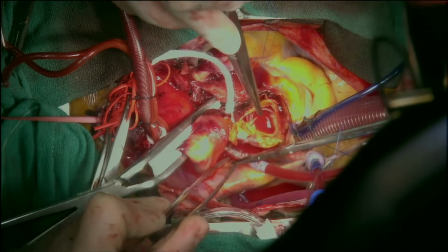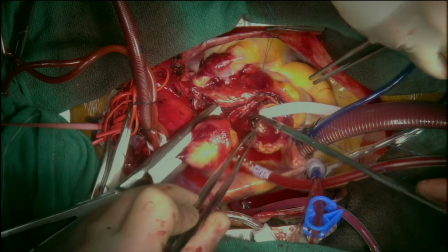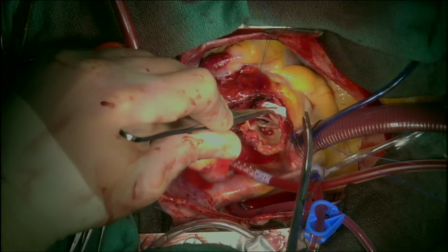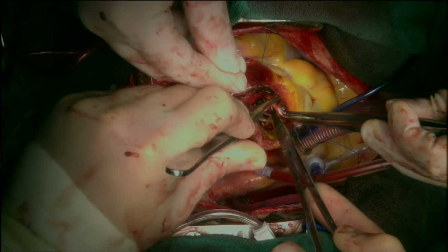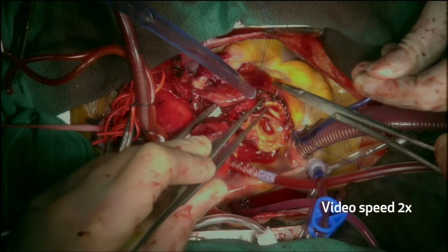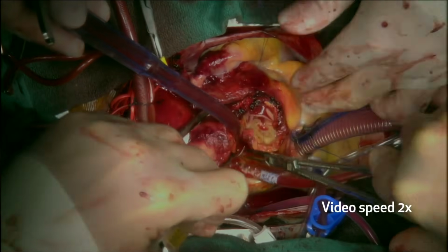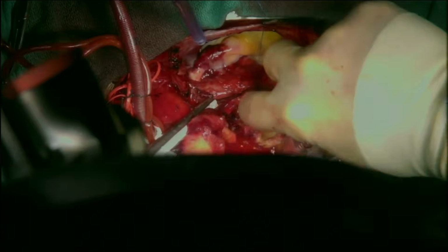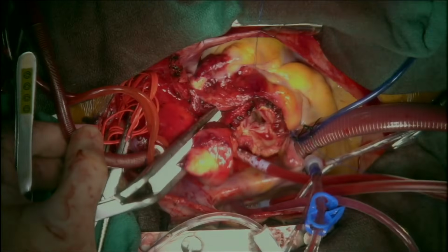There was good coaptation suggesting a feasible repair with valve resuspension. A felt strip was cut to be inserted between the layers of the dissected sinuses and secured at the sinotubular junction level with a running 5-0 Prolene suture in 2 layers. The sinotubular junction was sized and measured approximately 31 millimeters.